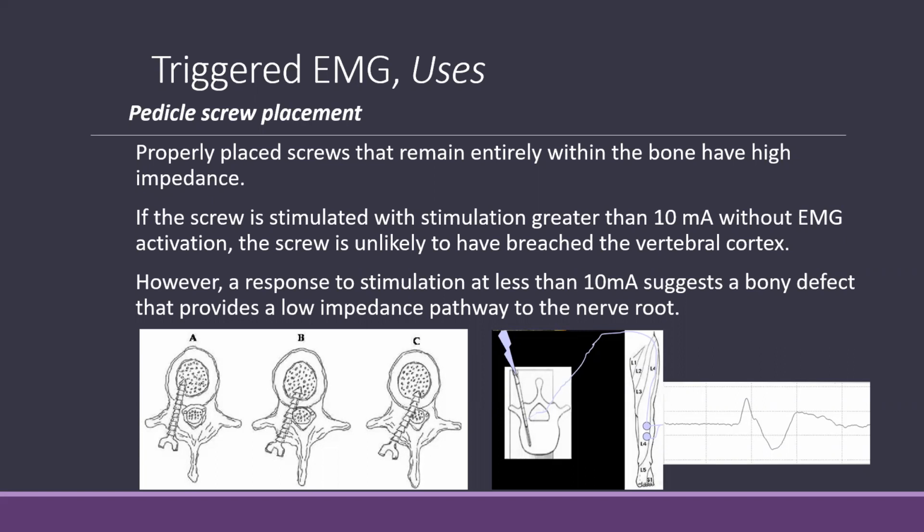However, response to stimulation at less than 10 milliamps may suggest a bony defect that provides low impedance pathway to the nerve root.